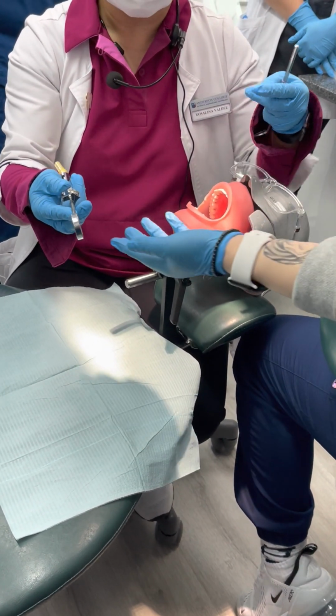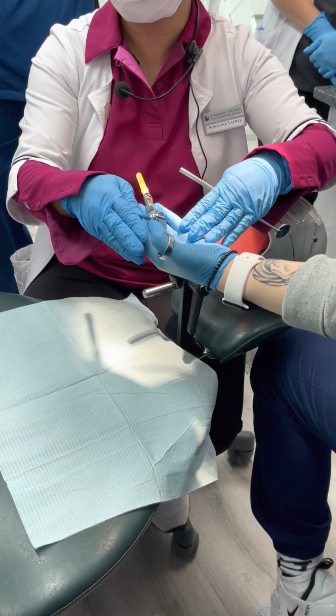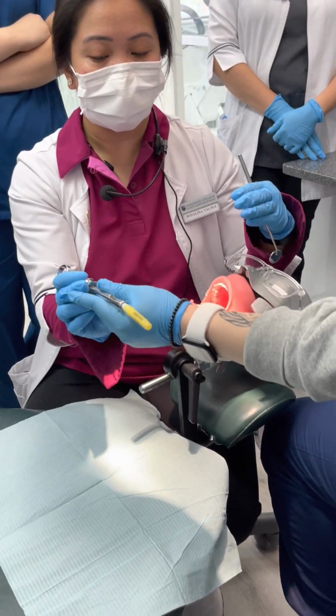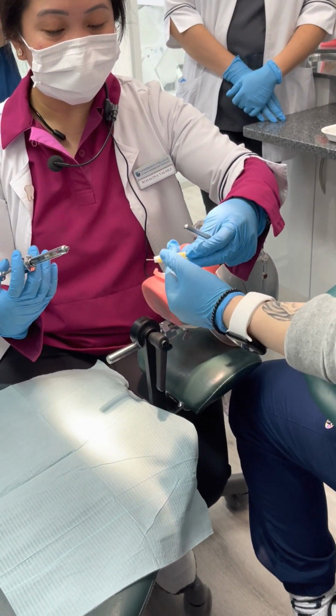Tomorrow, we're gonna do this physically. So hold it like that. And make sure she's holding it before you release it. Okay? So pass it to me properly. There. And then now, you remove that.